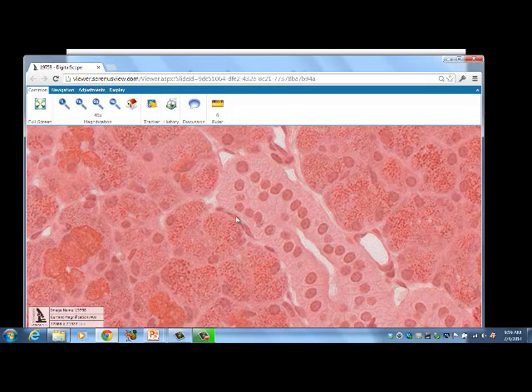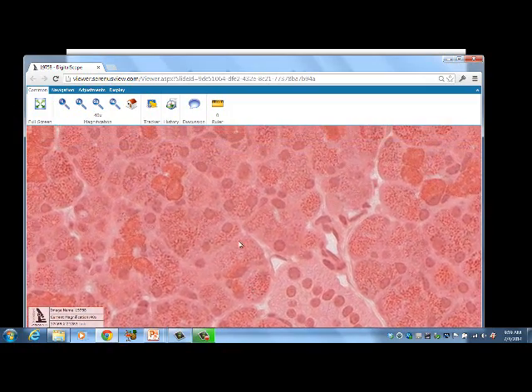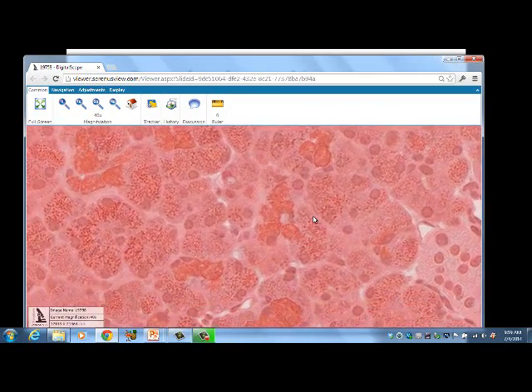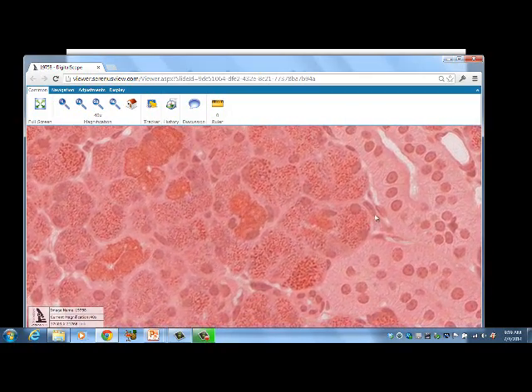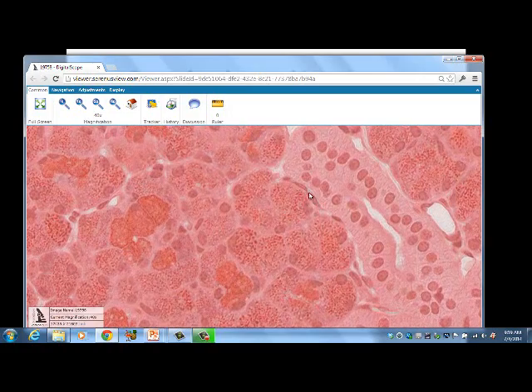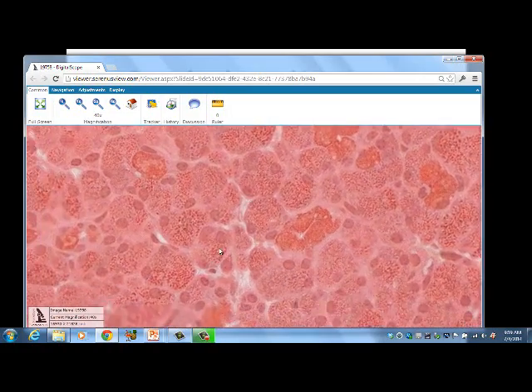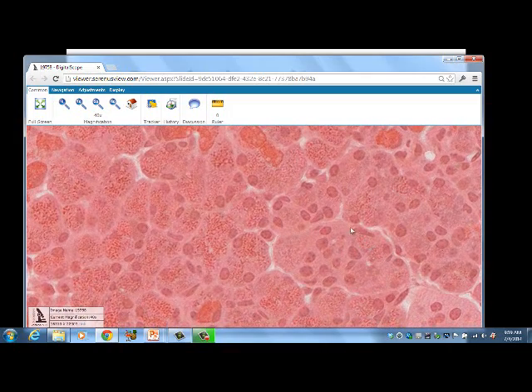And right around there we see the myoepithelium, which squeezes the secretions out. Let me make sure that's right. This looks like more myoepithelium right in here that surrounds the acini. Maybe that's fibroblasts in through there. So the myoepithelium you would expect to find around the acini itself like this.